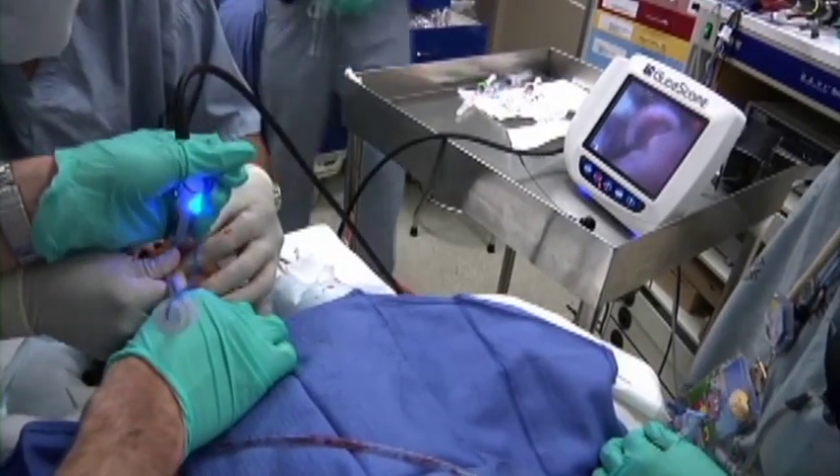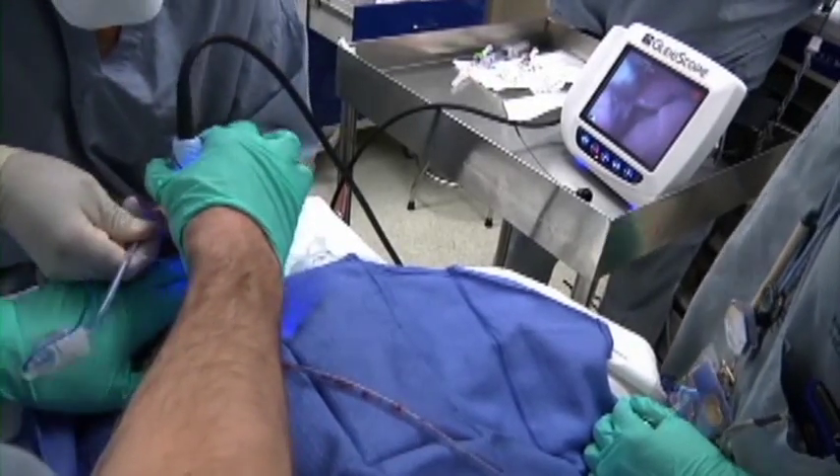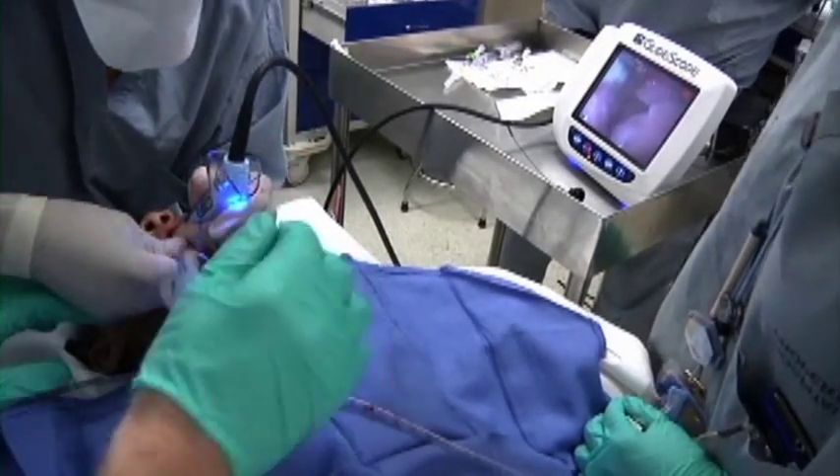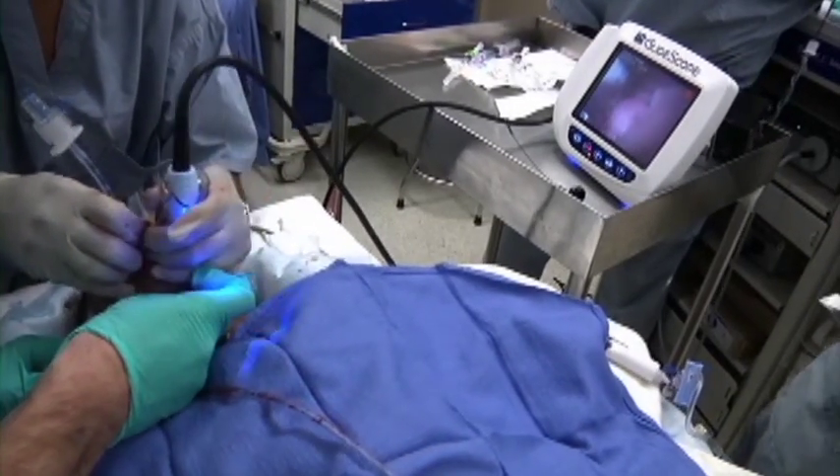Not obtaining the optimal view for intubation, we then decided to use the number two stat. This offered a better view but was met with challenges for insertion of the endotracheal tube. Successful intubation was achieved.